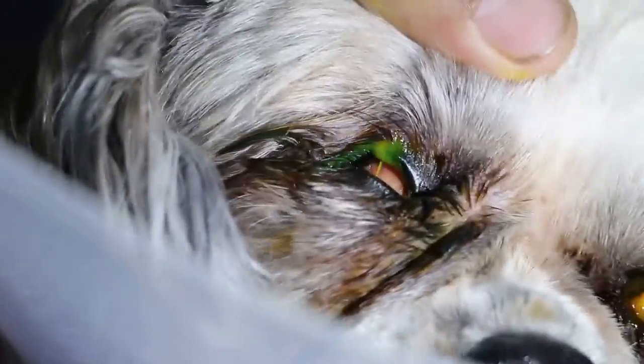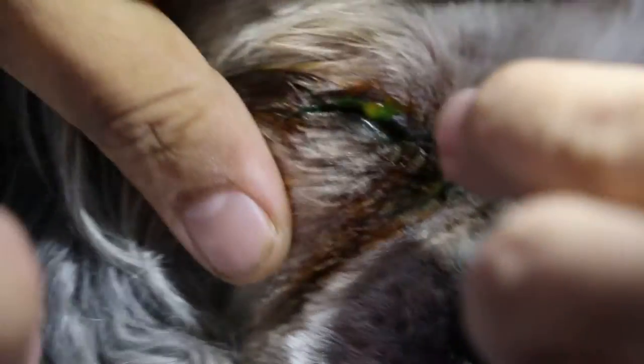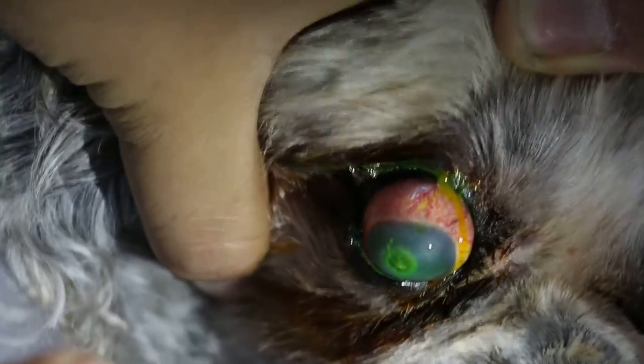This one I opened up first. Now you can see clearer because of the fluorescent stain. You can see the lower part. This is the same central cornea as the other dog, but the other dog's one is healed already. This one is a new one.